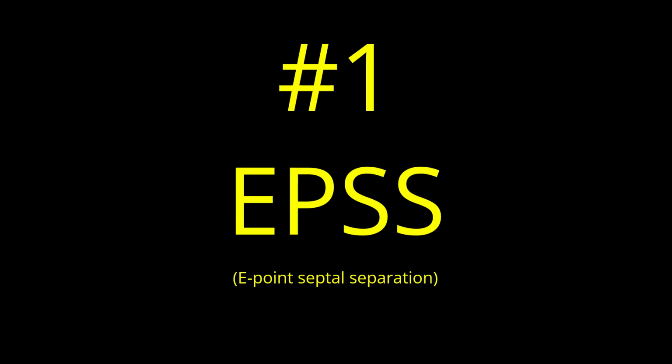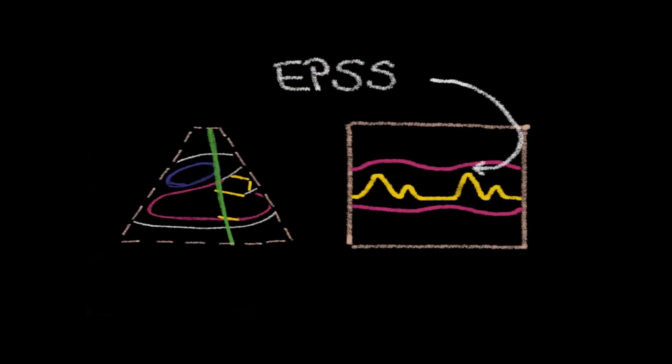We're going to discuss 3 different techniques to measure left ventricular ejection fraction, starting with EPSS. Why multiple techniques? Well, each one has limitations that we'll discuss. E-point septal separation, or EPSS for short, takes advantage of the mitral valve movement to measure the ejection fraction. You'll notice that we use the M-mode cursor here through the anterior leaflet of the mitral valve here at the tip. And if you look at it through the cardiac cycle, you'll notice in diastole there's 2 waves. First, there's an E wave here and an A wave. And you'll measure the distance here between the peak of the E wave and the septum, hence the name E-point septal separation.